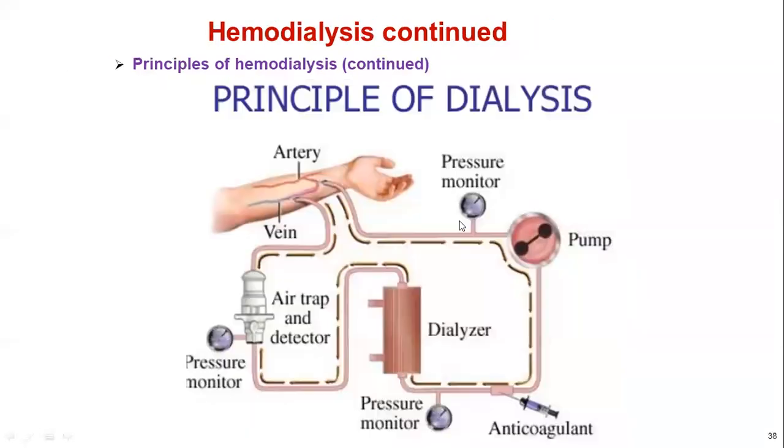Okay. So next, the basic principle of hemodialysis, we are going to discuss a little bit through a picture. Right. So you can see this is the human hand, the artery and vein. Usually in a normal healthy individual, it is not like this.